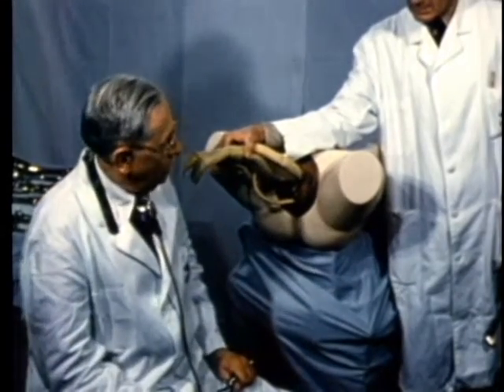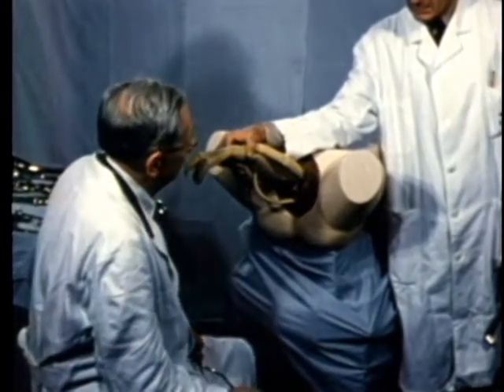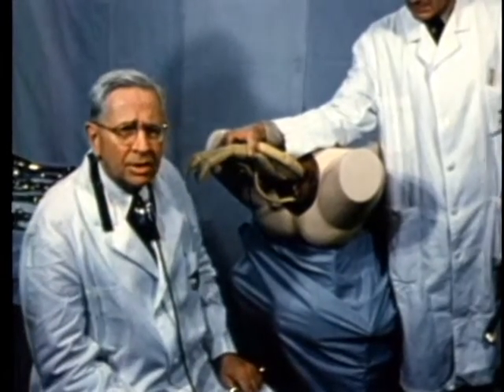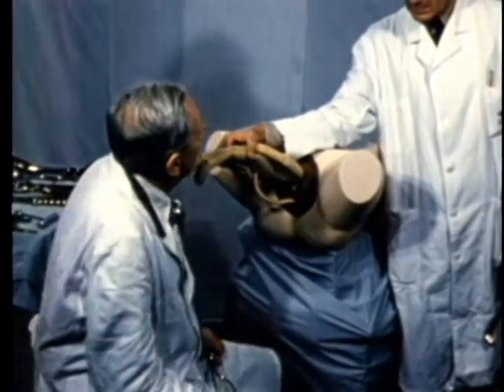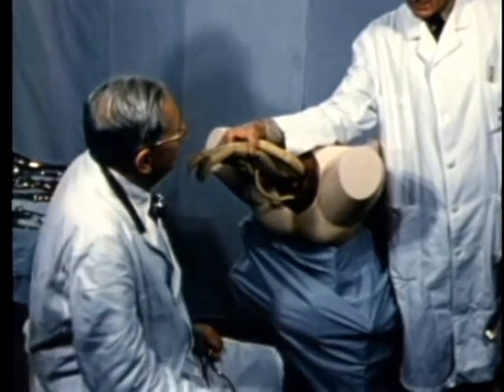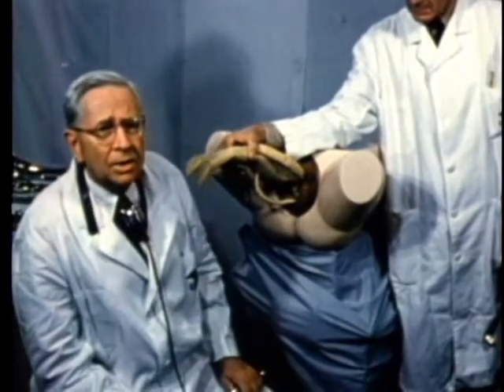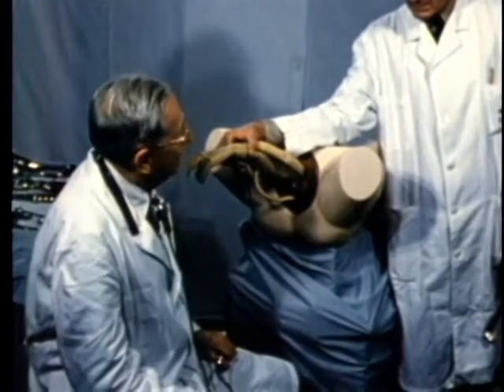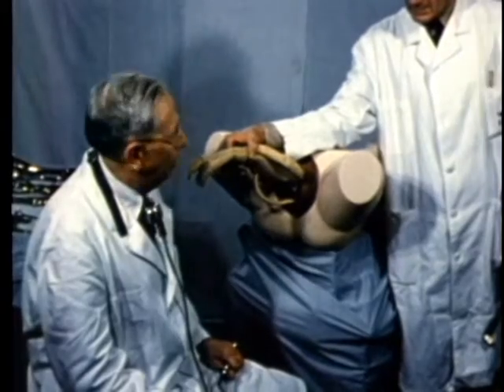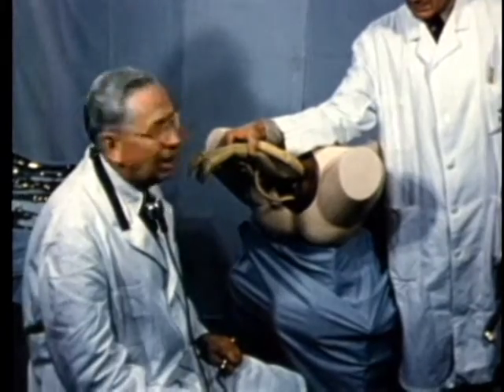The operator assumes the sitting position. Piper advised the kneeling position, and he stated that when one is confronted with a situation of this gravity, it is advisable to adopt the attitude of prayer. But over the course of the years, it has been found it is a little more comfortable to sit down when making the application, and one is not under any great stress as he would be if on his knees and feeling that he had to get off the floor without assistance.